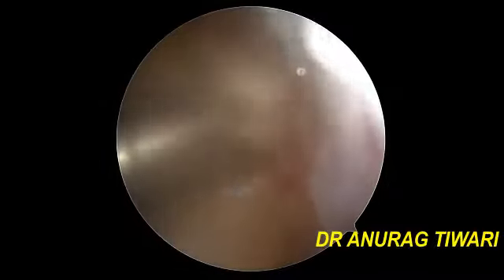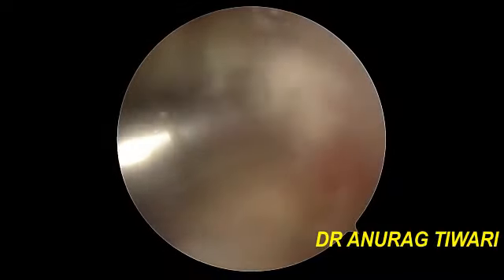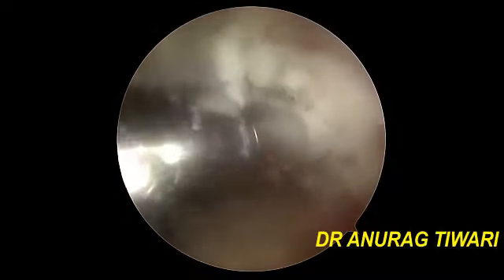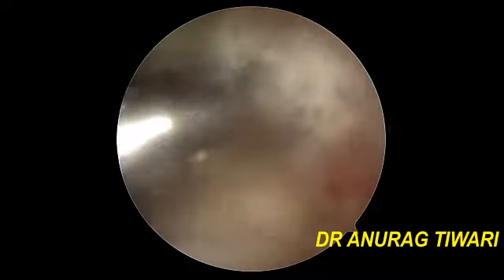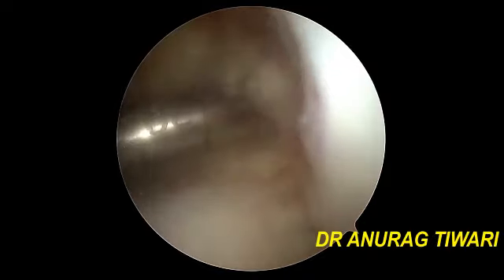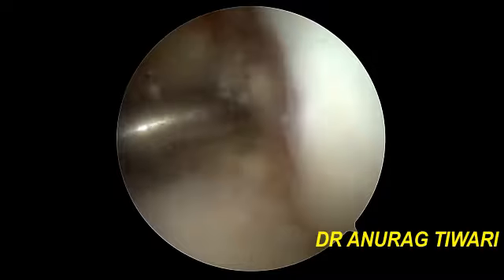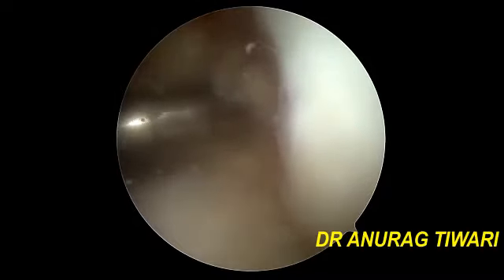Now the length of the femoral socket is variable. It depends upon whether you are using a fixed endo button loop or the adjustable one. So in my case, I am using an adjustable endo button. I usually drill up to 20 to 25 mm of the length. So this is the 20 and this is 25. So 25 mm length has been reamed adequately.